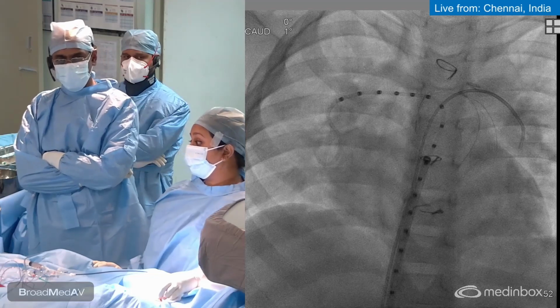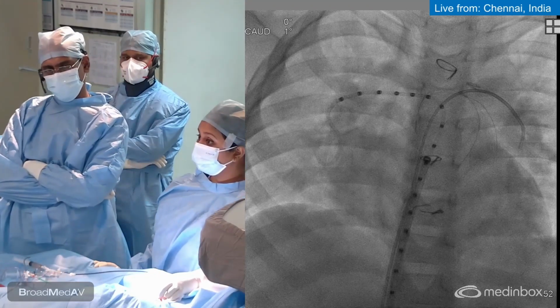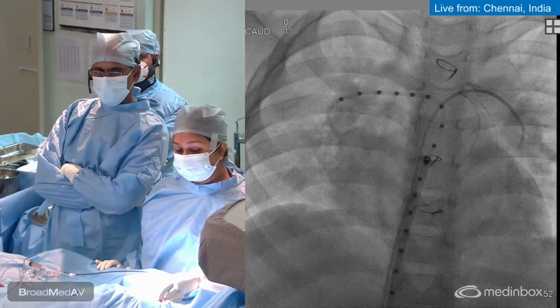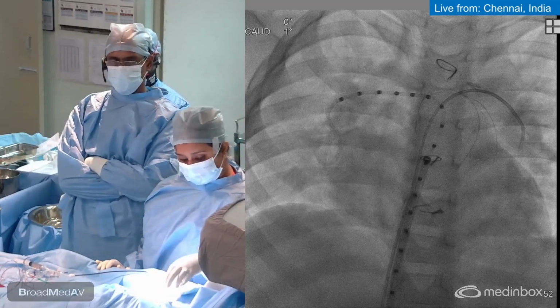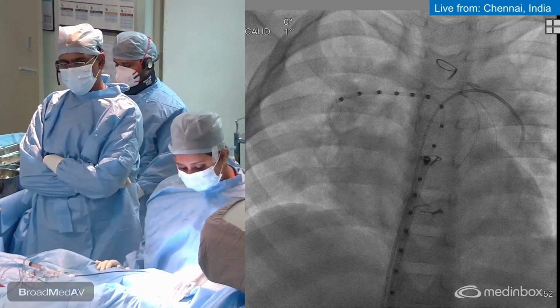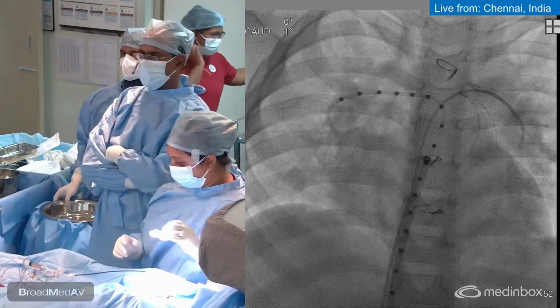In this particular patient, when you are showing the images, the narrowing of the right pulmonary artery and left pulmonary artery were right from the origin itself. And hence, thought it may be safer to have two sheaths so that we can position the two stents, check that both are not going to be interfering with each other.